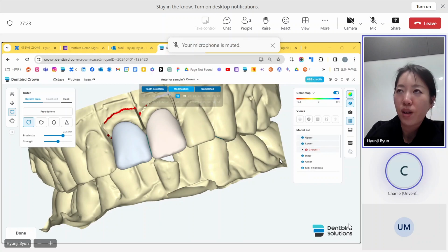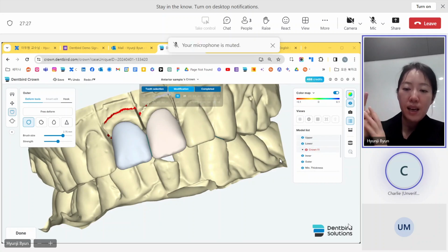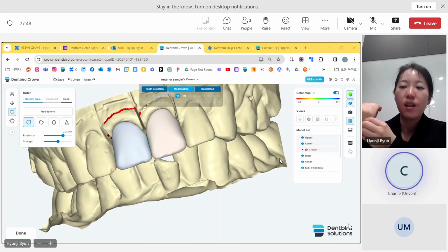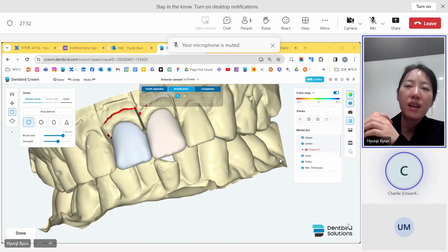I'm just curious, if you're not a dental tech and you haven't had any experience with printing crowns, you might have trouble doing it. So that's why we want to test. We need to design and then print, and after printing, we will know the problem. I see. Sure.